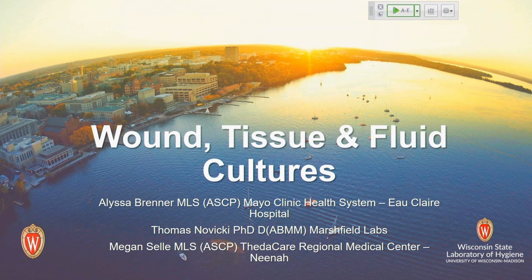That's a best practice. If someone has an infection, common things being common, they're probably going to survive in that. But you always worry about the fastidious things that aren't going to survive. Specifically, I don't know if anyone is still doing Neisseria gonorrhoeae cultures. Well, you look at a molecular test in those situations. And again, I think that's probably pretty rare these days.